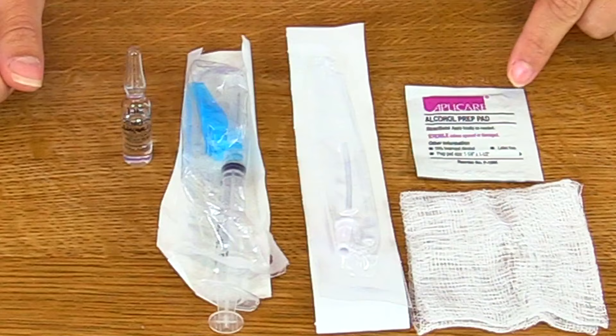You also need a gauze, because we're going to use it to assist us in breaking the glass ampule, and some alcohol prep to help you clean the neck of the ampule before you break it.